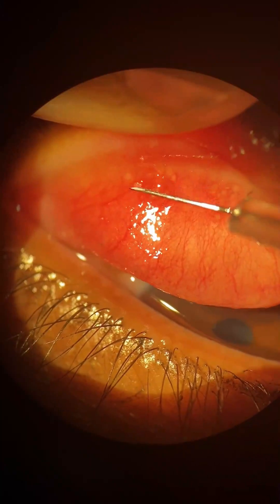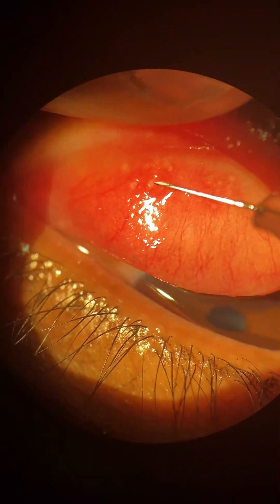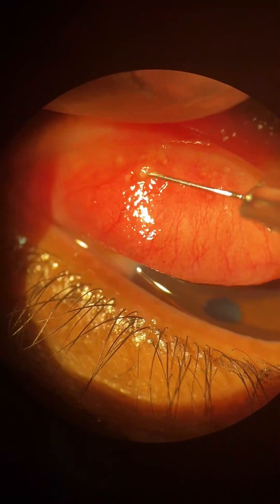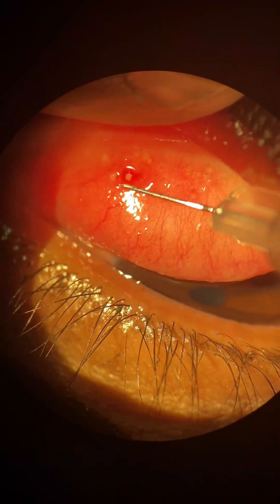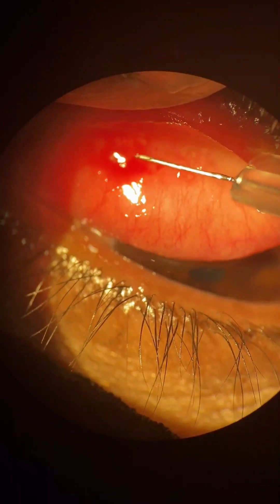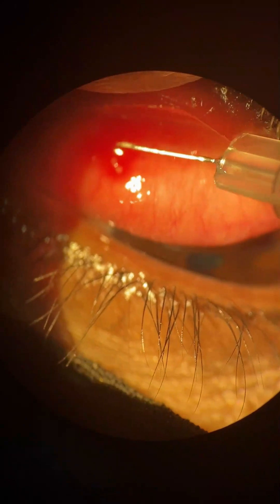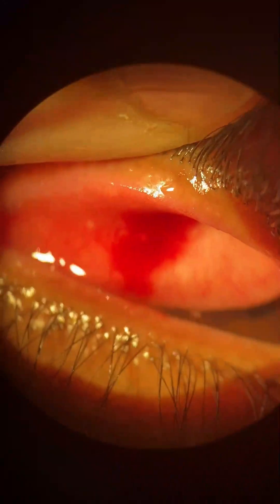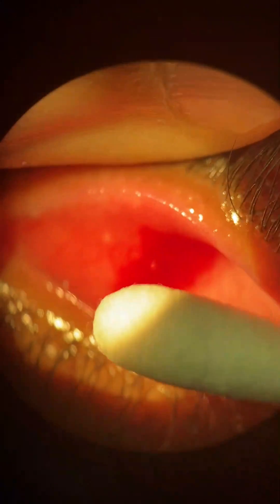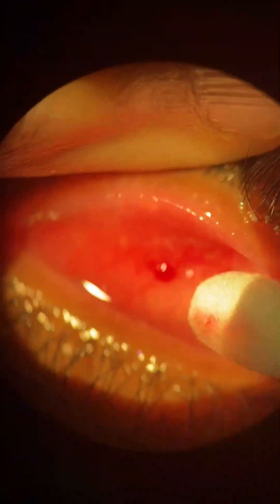Protruding conjunctival concretions like in this case should be removed. Under topical anesthesia with tetracaine drops, a 30-gauge insulin needle was used, with the bevel directed away from the cornea to scrape the concretions out. Concretions were then removed with a cotton-tipped applicator and the patient prescribed an antibiotic corticosteroid combination eye drops.